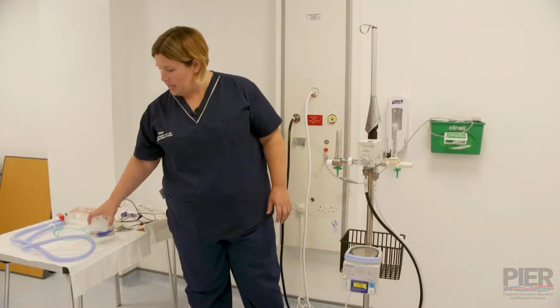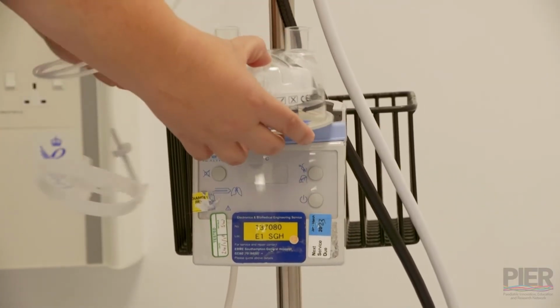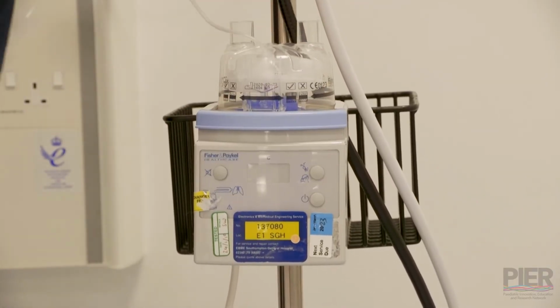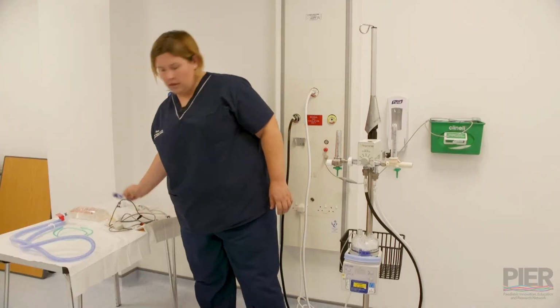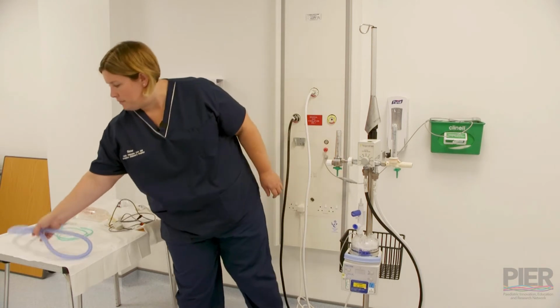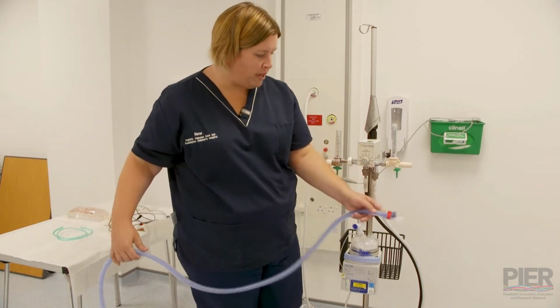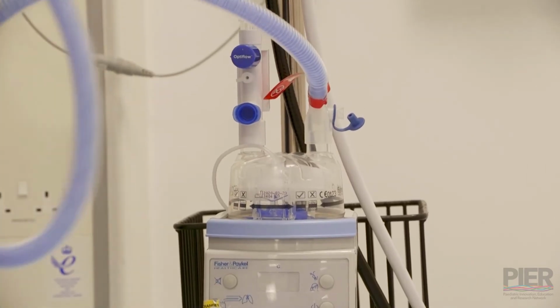To set it up, you're going to take the humidifier chamber, push down the blue bar at the front and slide your humidifier chamber in. You're going to take the flow limiter, pop that on one side of the humidifier chamber. Take the circuit that's going to provide the flow to your patient and put that on the other side.